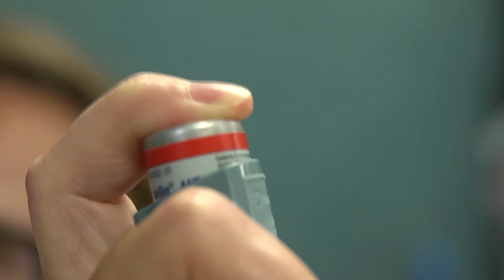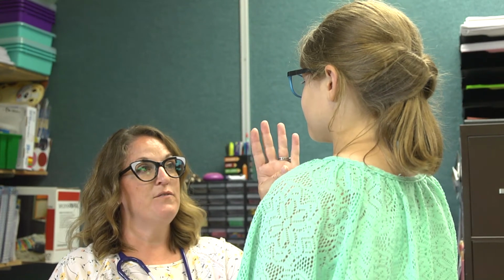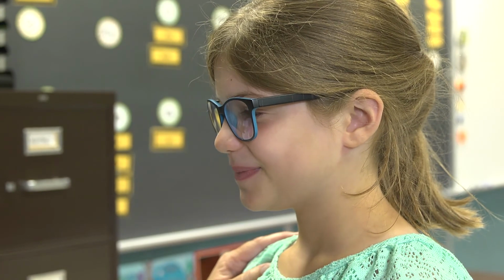Press down on the top of the inhaler once as the student breathes in very slowly until they have taken a full breath. Instruct the student to hold their breath for 5 to 10 seconds. Instruct the student to breathe out slowly through their mouth. Wait 1 minute before having the student take a second puff if ordered. Repeat previous steps if taking a second puff.